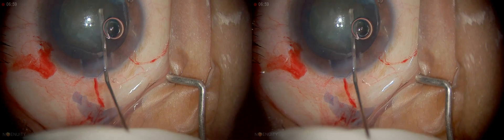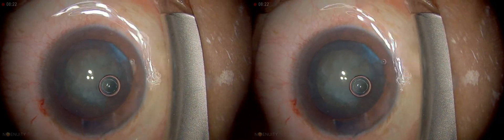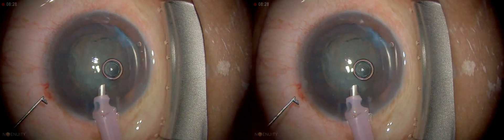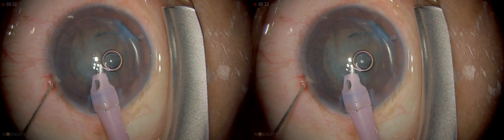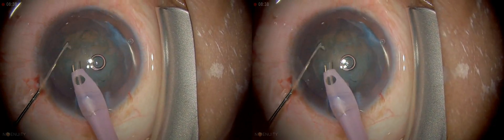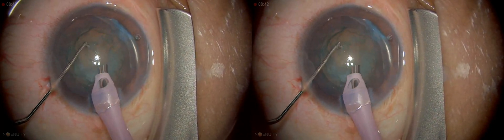I'm going to start the phaco and go into foot pedal position one, going in very gently. You can see I'm having the tip turned sideways. I'm just going to remove some of the viscoelastic to enable flow to occur, because if there is no flow it's going to heat up and you can get an incisional burn.